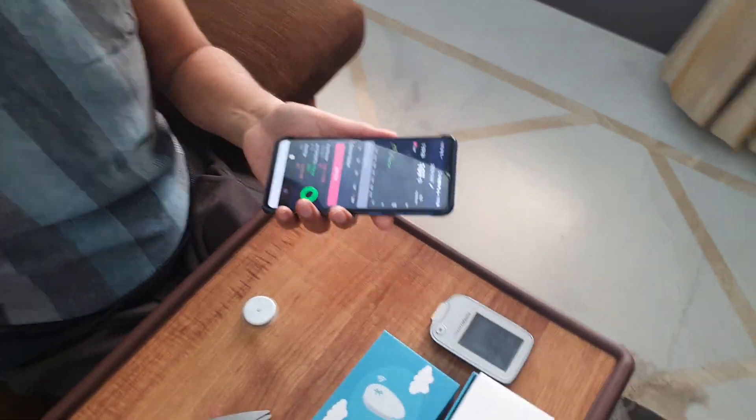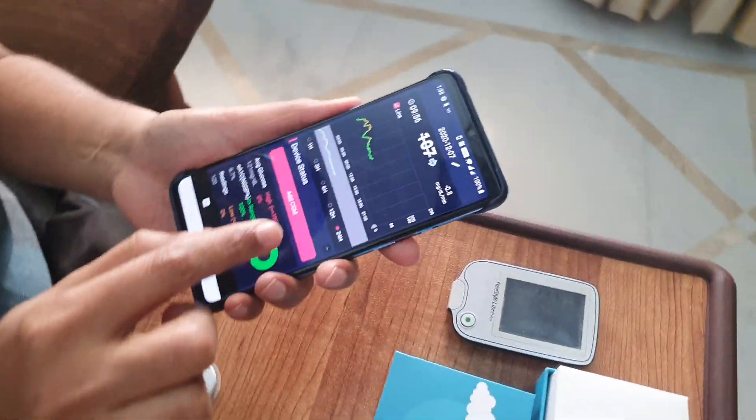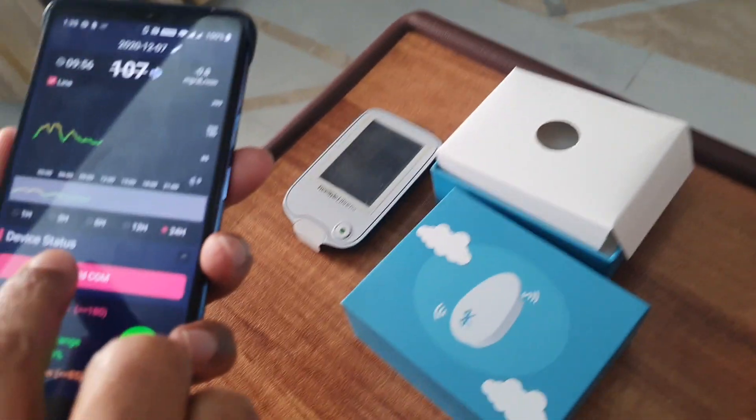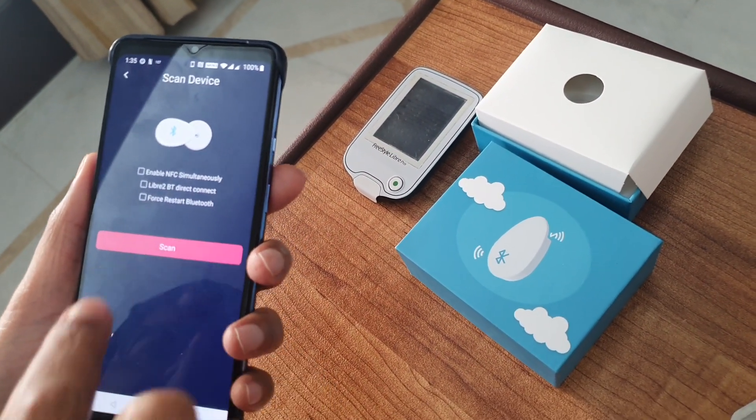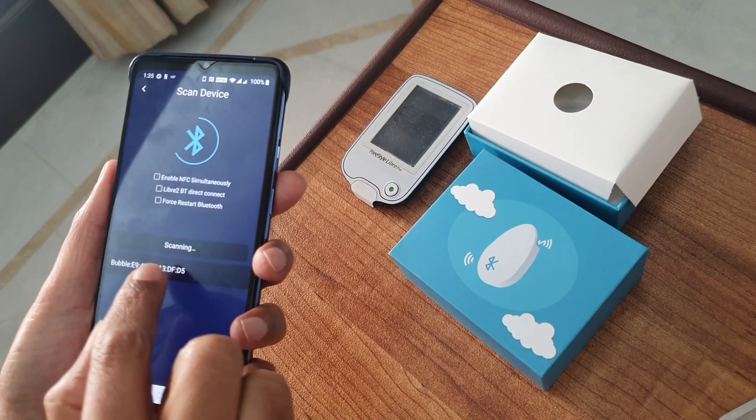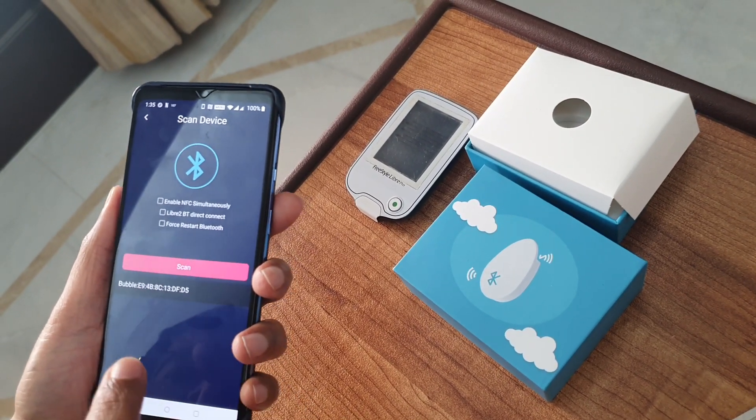Now we can check on the device whether this is working. We simply go to Add CGM, select Abbott, and scan. Since this is ready to scan, we just click here.